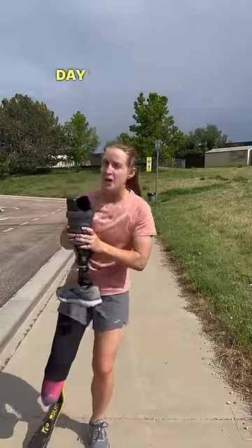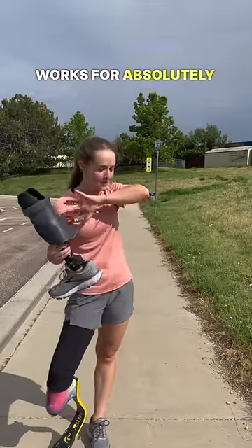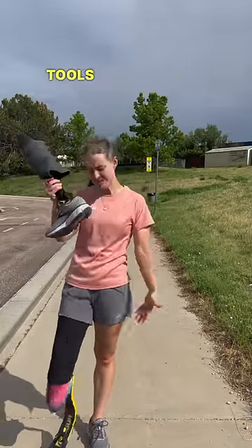I do indeed dream of the day where maybe there'll be an all-in-one prosthetic that works for absolutely everything, but for now we have different tools for different jobs.